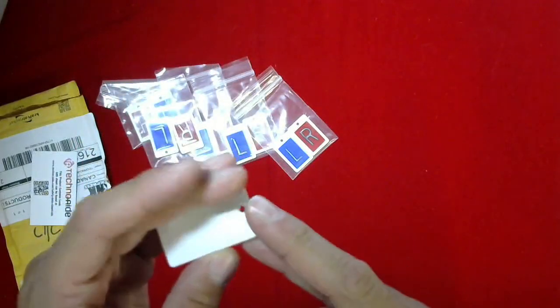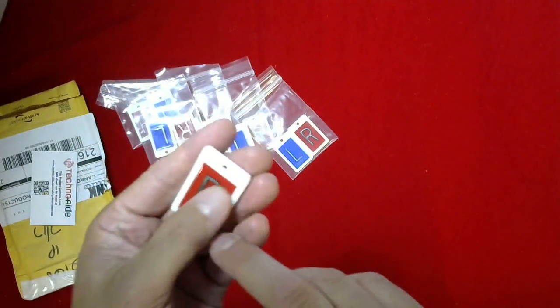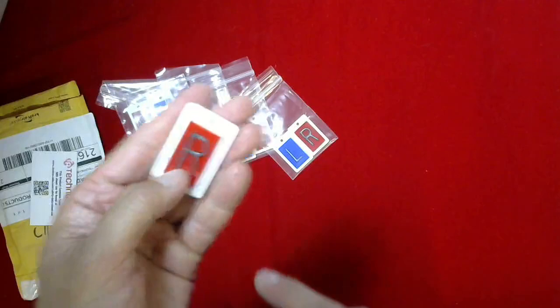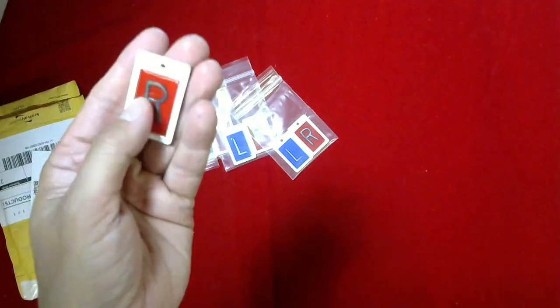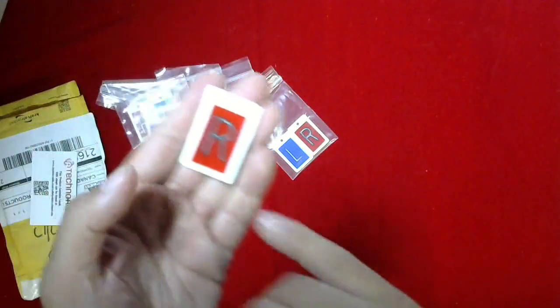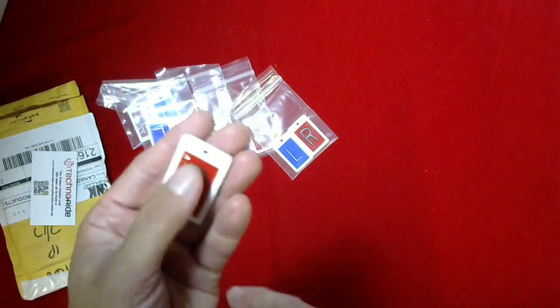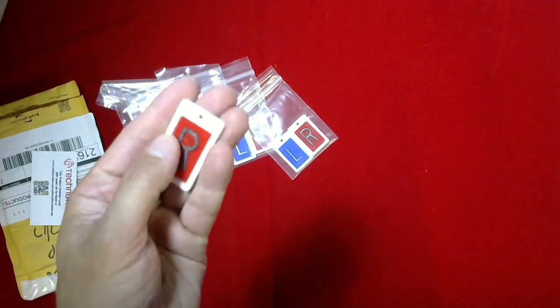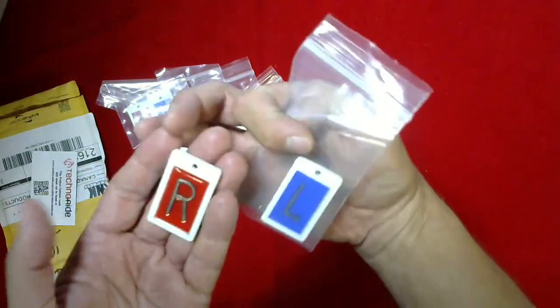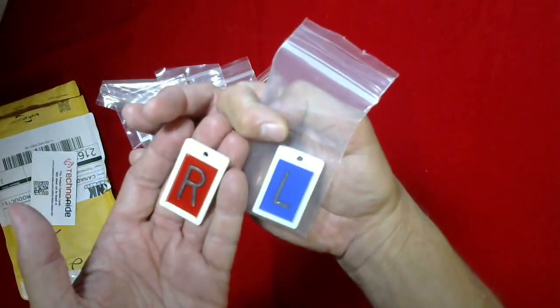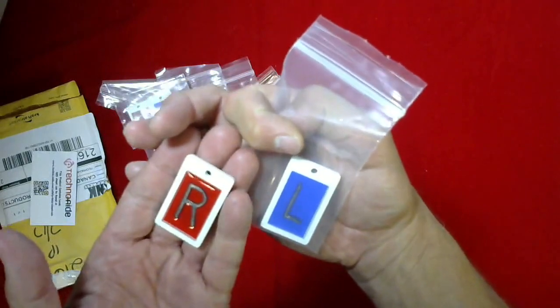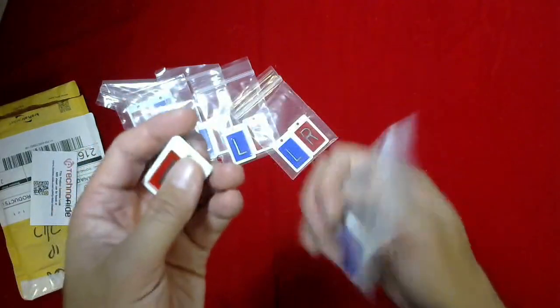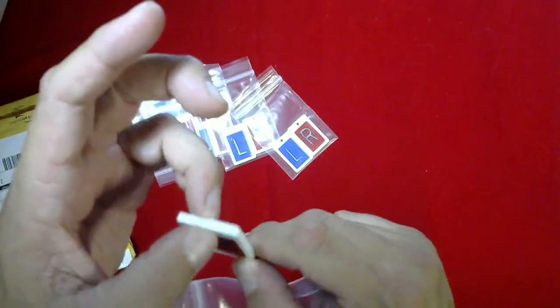This is a plastic marker with, I'm assuming, a lead letter there and an epoxy coating. You've got the left and right, both in red and blue, and then there's a little hanger.